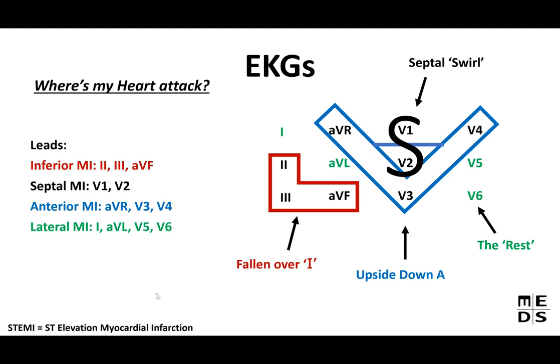And then I have down here what STEMI means. So it's ST elevation myocardial infarction. So the ST elevation, meaning that segment of the EKG, I really wish I put it in this part of the slide to make it more simplistic to see what I'm talking about, is that one portion of the EKG is actually elevated, and then myocardial infarction means heart attack.